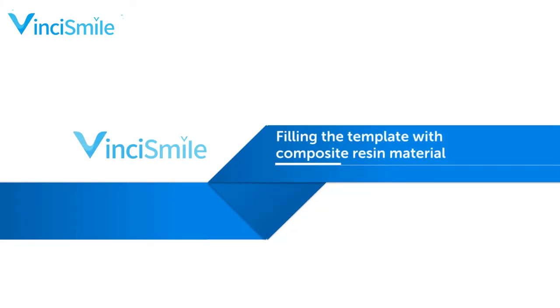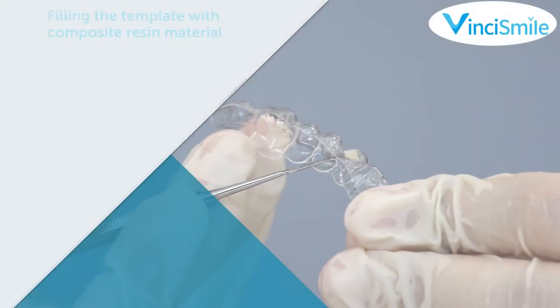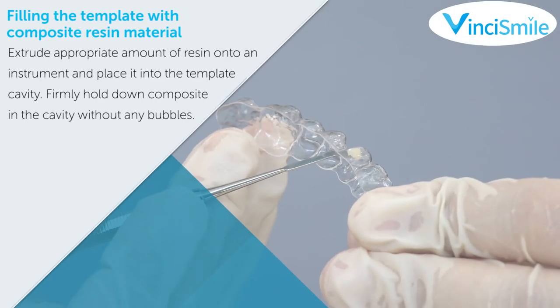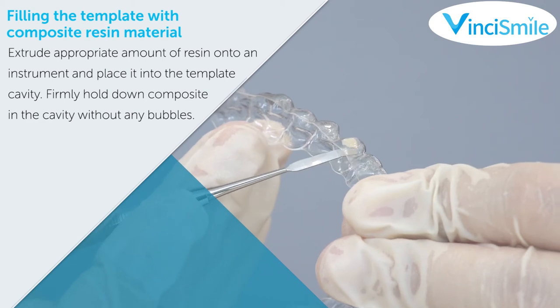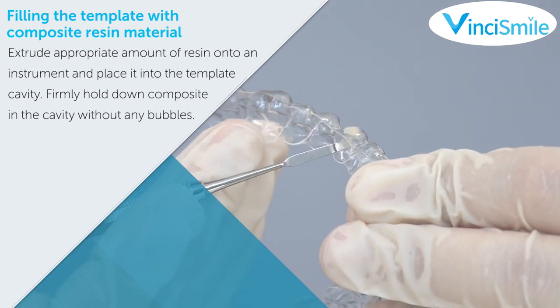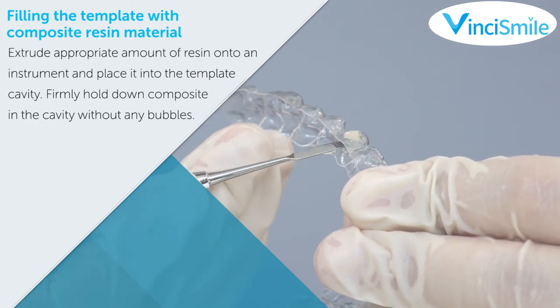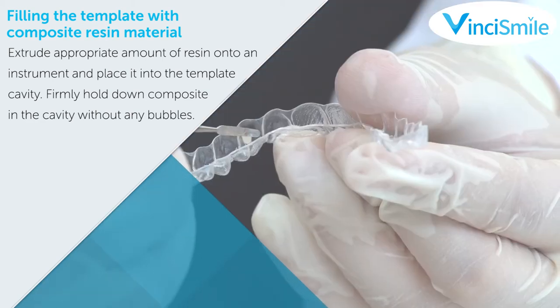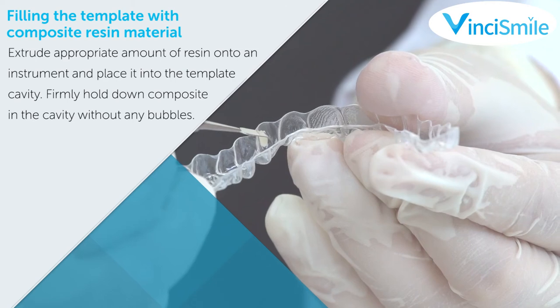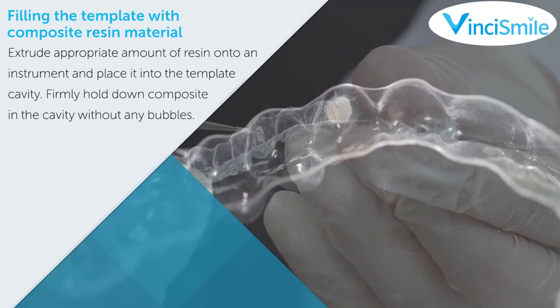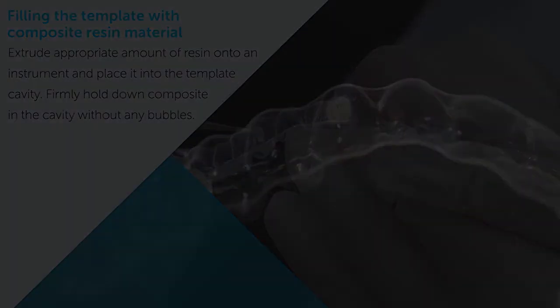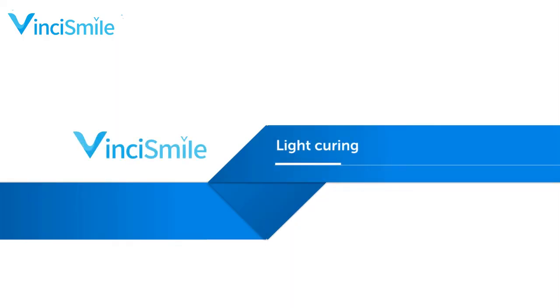Fill in the template with composite resin material: extrude an appropriate amount of resin onto an instrument and place it into the template cavity. Firmly press the composite into the cavity without any bubbles.